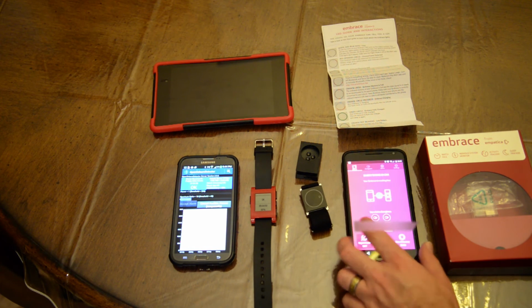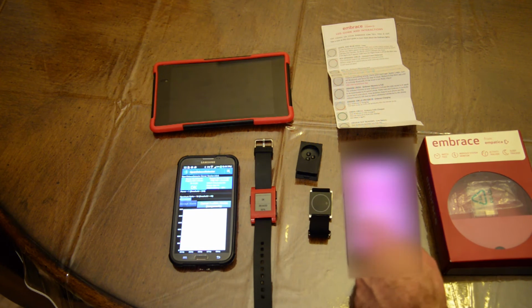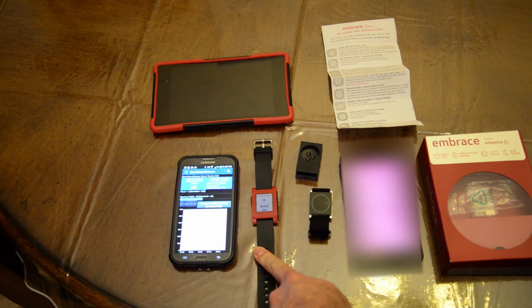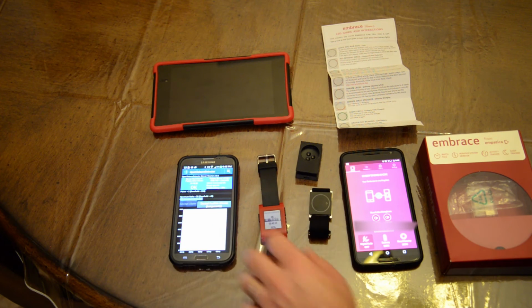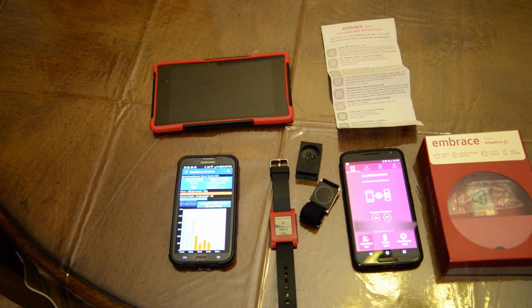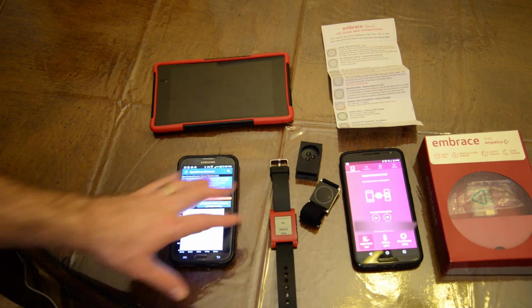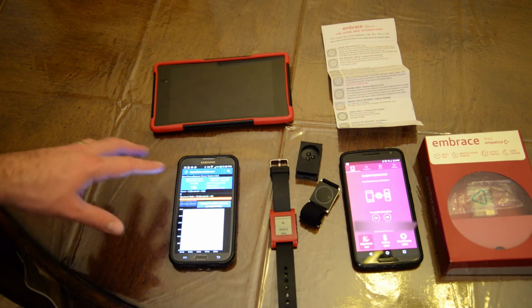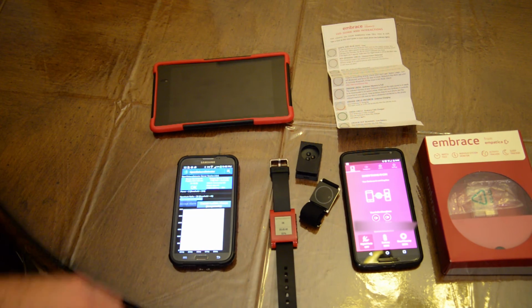For comparison, this is all the information you get. You really don't know if the information is going through. You know the device is here, but there's no data end for us nerds to actually look at. In this case, you can see the device moving around. You'll see the data processing here, propagating here, as well as the threshold being propagated across there eventually. You can see here, it will show exactly what is moving, how much of a load it is getting forced upon the accelerometers, so you can actually see the data. Plus, this is a server in itself, so in our demonstration in the previous video, you can actually log in to this IP address locally with another device like a tablet or a computer or another cell phone, and you would actually see this data going across.